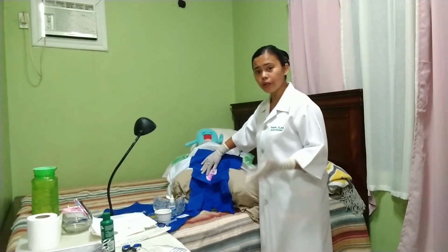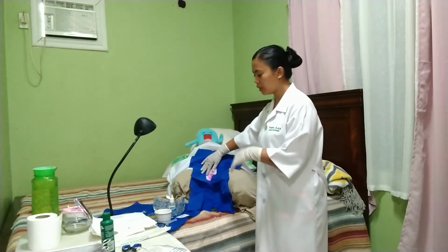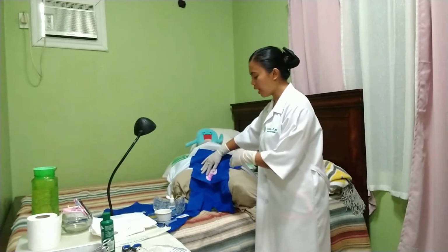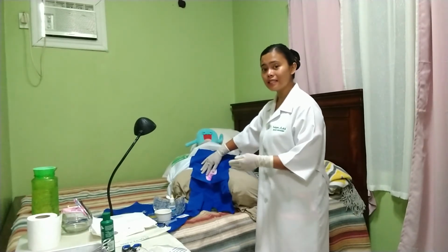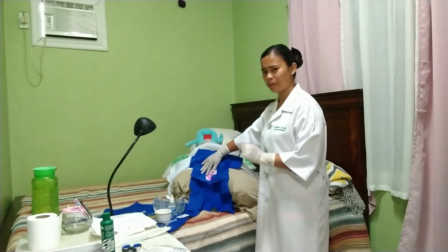So using our sterile hand, we have to pick the collection container as well as the kidney basin, and put it near our patient's perineum area since this will catch the urine when the urine flows and it will prevent soiling the bed.